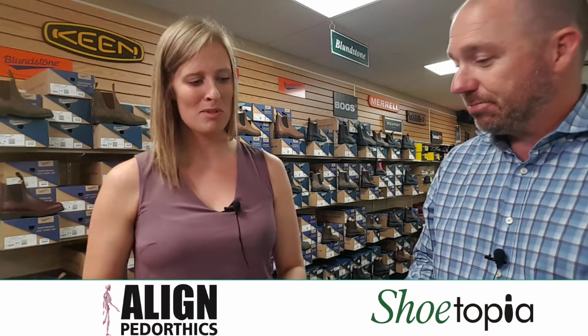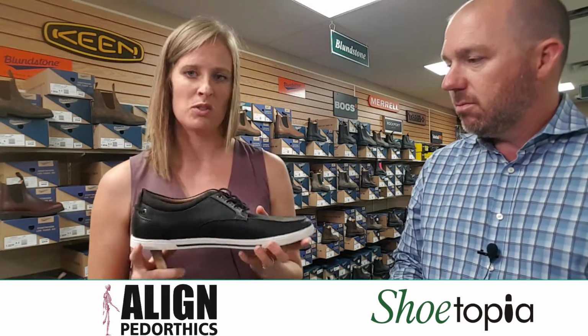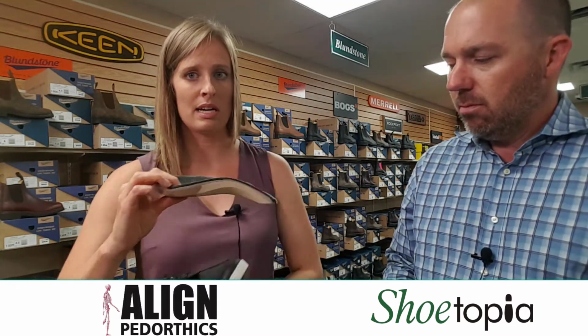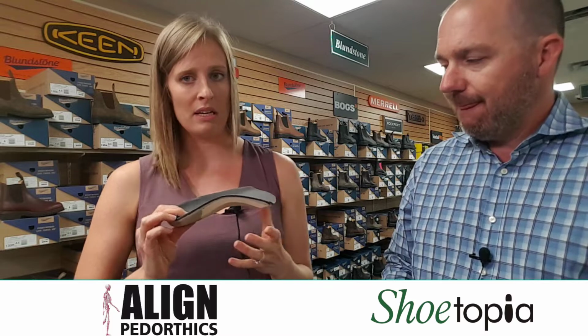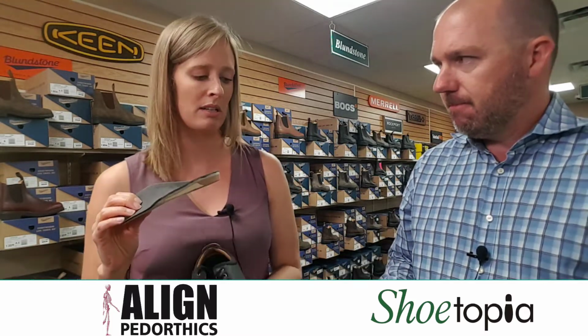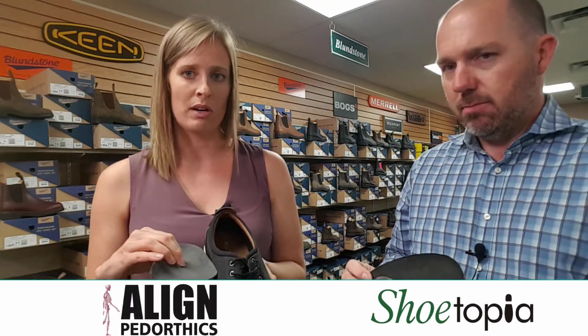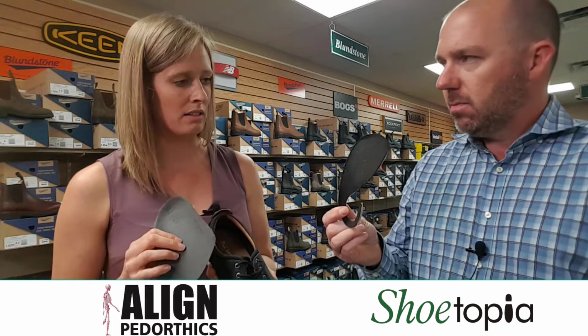So then the next option would be for a dress pair of shoes. So this is a men's dressier shoe, would be the 3/4 length. So you can see that this one doesn't have the full length piece. You don't have to worry about an insole coming out with a shoe, with an orthotic like this. Yeah. So it just sits in on top of whatever's already in there, as long as you have the space, and that gives you more versatility.